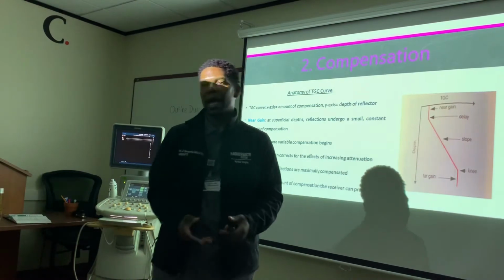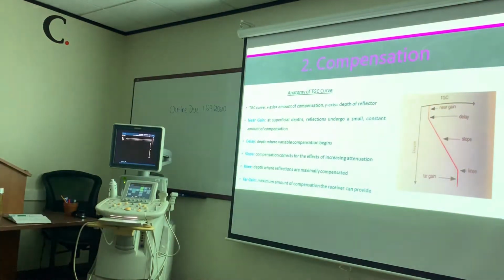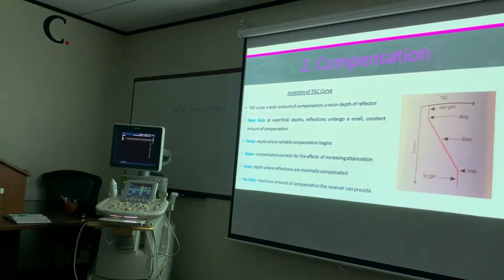So it's gonna kind of give you that optimal. I don't have any anatomy. If I'm gonna scan later, I'll have to show you how that works. Okay, because sometimes it doesn't work good all the time. Sometimes it'll make your image too dark or too bright.